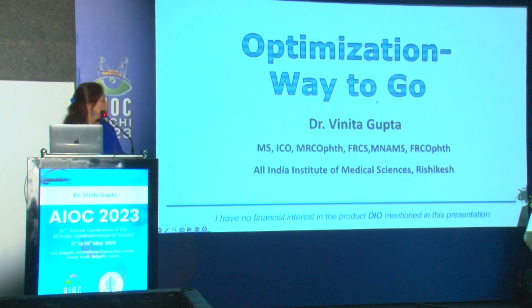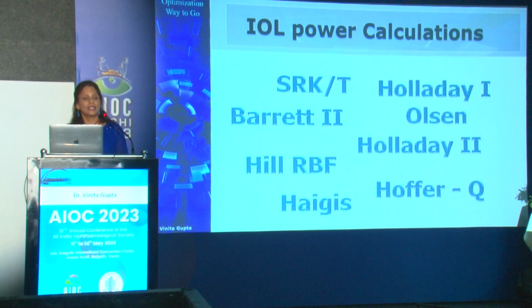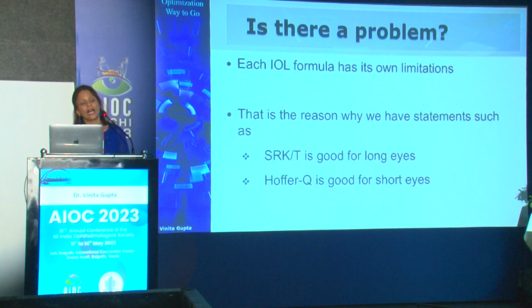So optimization, what is optimization and is it the need of the hour? I would say it is the need of the hour. It is the way to go if you have to become a cataract refractive surgeon. As I have already said in my previous slide, we have an armamentarium of IOL formulas which are working quite well. It's not that they're not working well, but remember each IOL formula has its limitations.